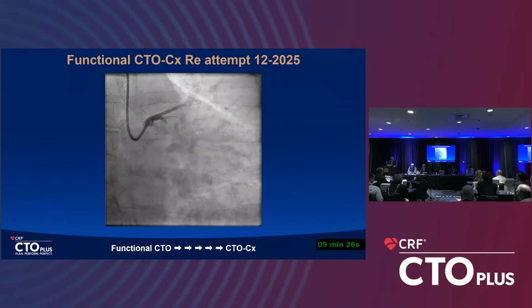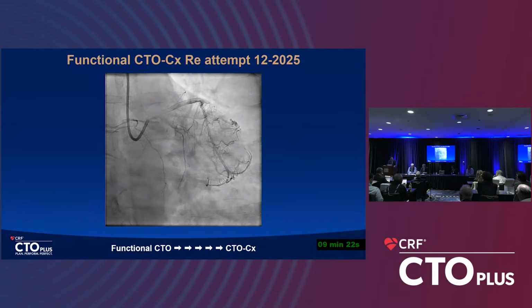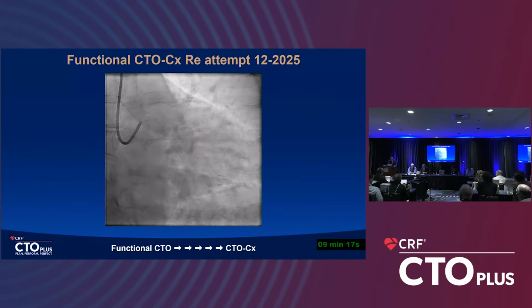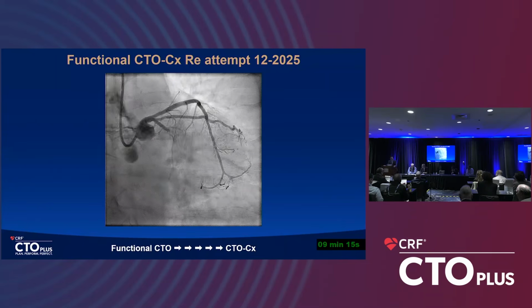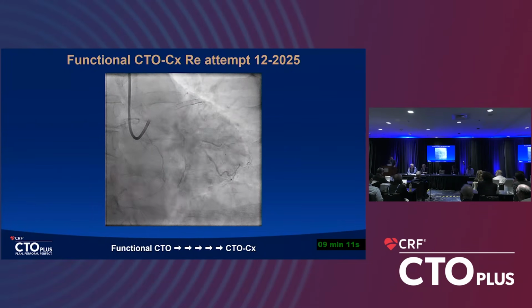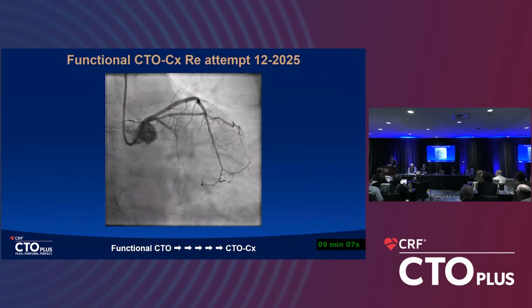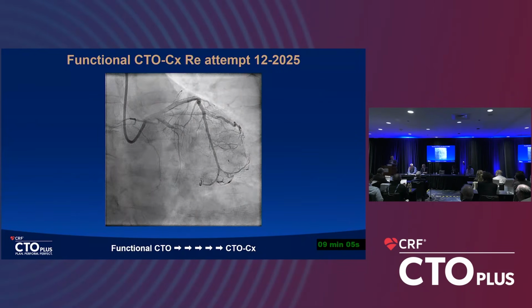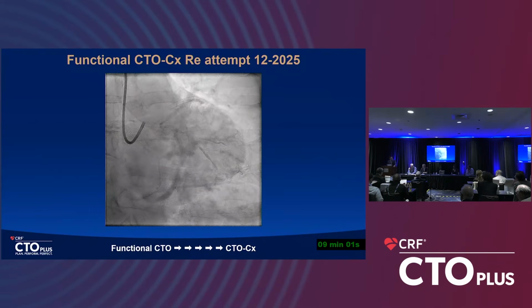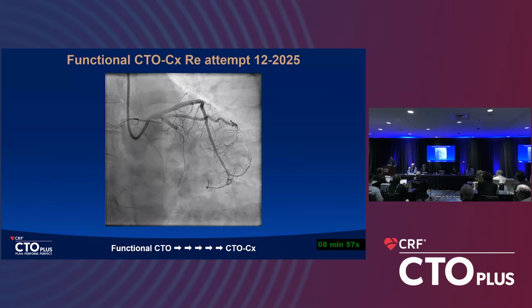So in the past, I would have always started this case with an XTA. More recently, I've been starting to use the Gladius, but not the Mongo, the EX. Interesting. And I would vote for Gladius myself, because the issue with Mongo is it's got the weak point 5 millimeters back from the tip, and it's perfectly fine as long as you can chase it with your microcatheter and keep that weak point from buckling inside the lesion and sliding past.